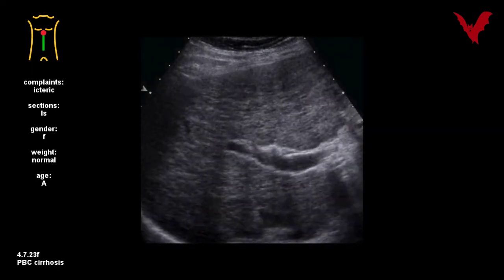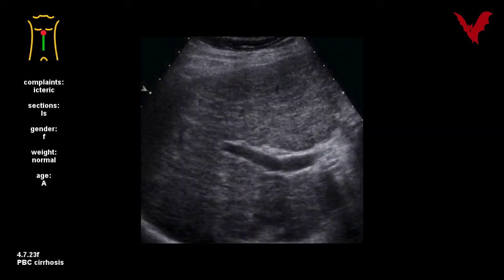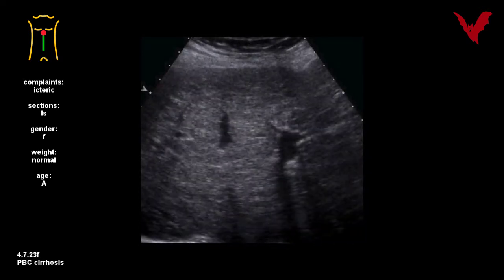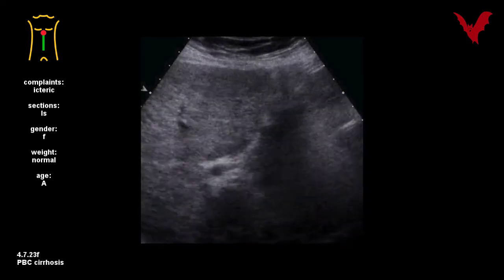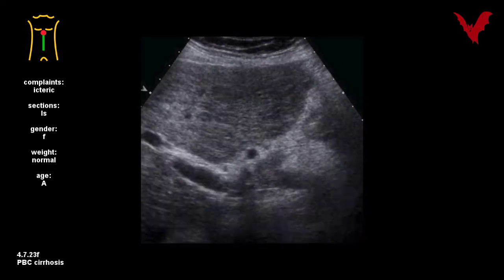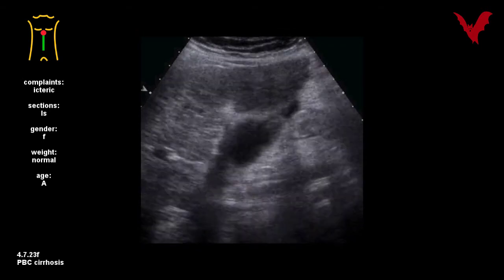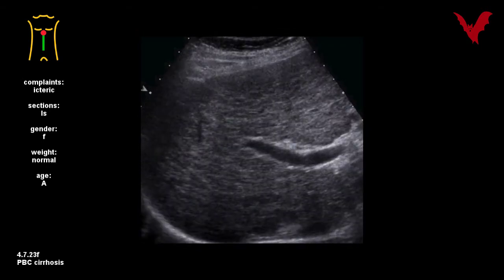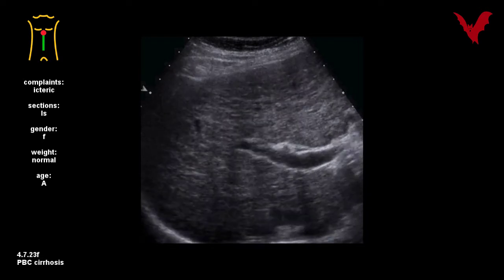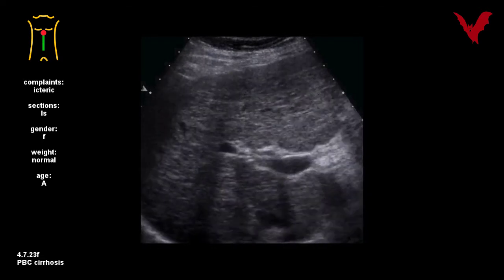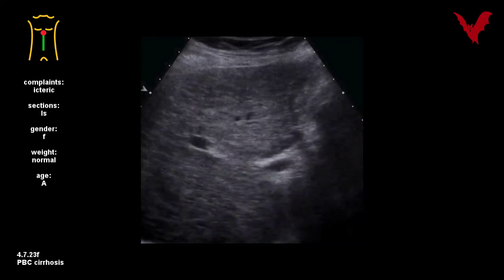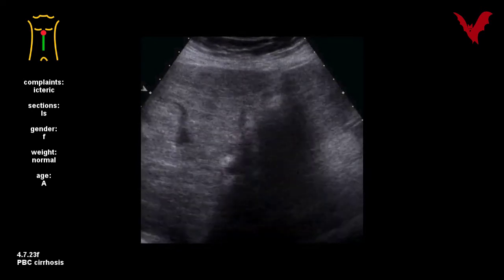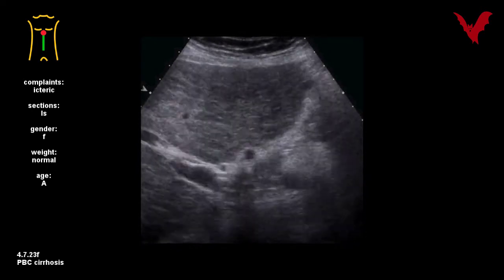Such a typical case of liver cirrhosis is seen in 4.7.23f, as a common end stage in long-standing liver inflammation, here in PBC — primary biliary cirrhosis.